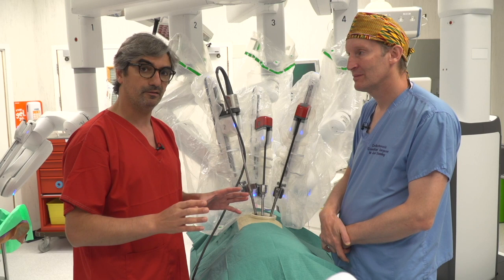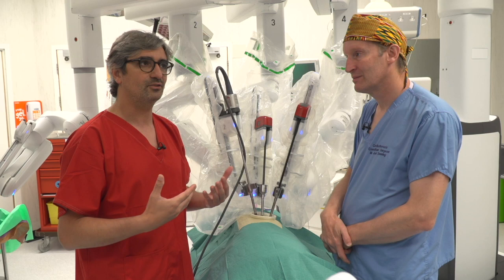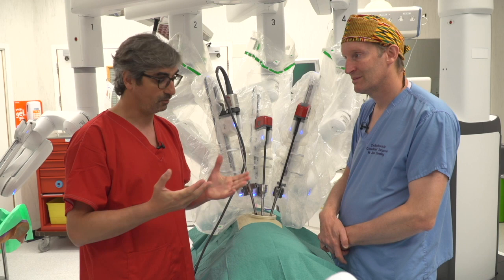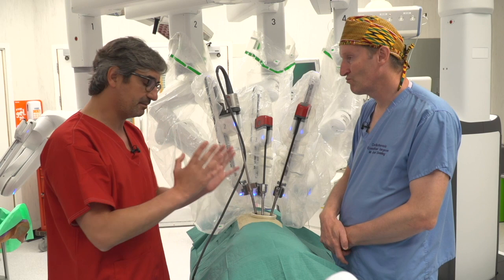Because in this kind of hybrid uniportal RATS, you need to have your assistant. And you are leaving your assistant one of the most critical parts of the operation in VATS, which is the use of the staplers. Well, you need to remove one arm. Sometimes there's not enough space. So we believe in the pure uniportal RATS concept with robotic staplers.